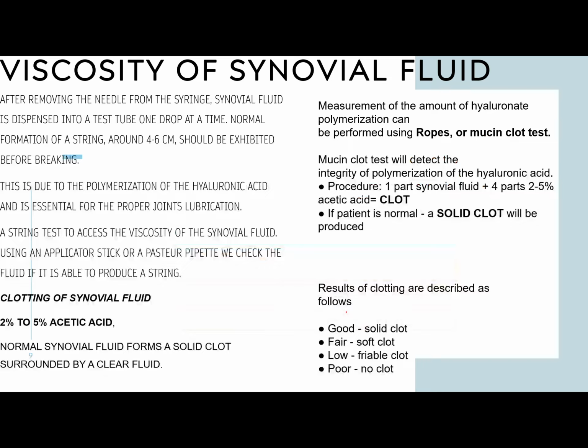Now, whenever the doctor would collect the synovial fluid, there is a test. You would dispense the synovial fluid into a test tube, one drop at a time. Then there would be a formation of a string around 4 to 6 centimeters before the string would be broken down.